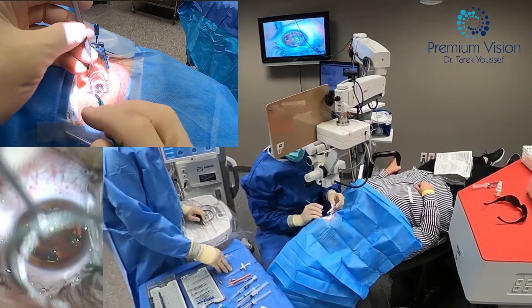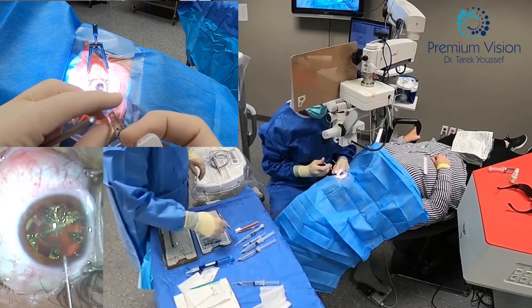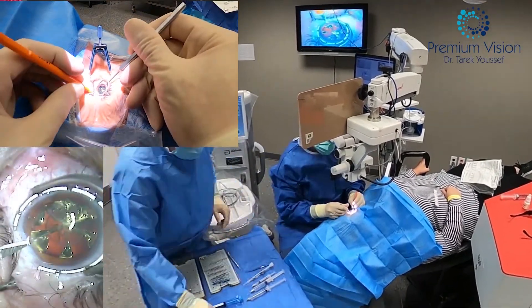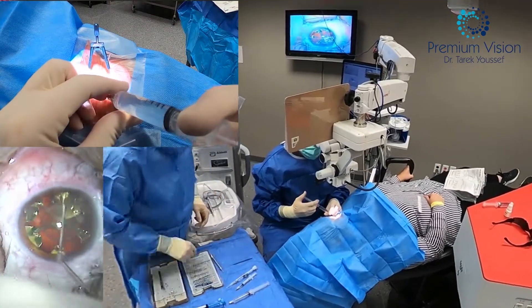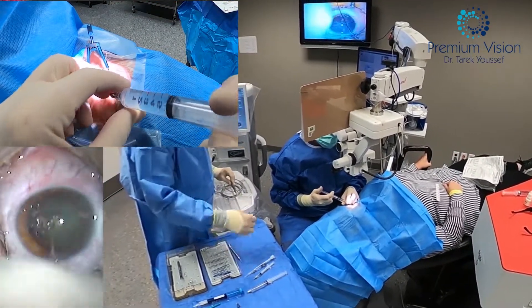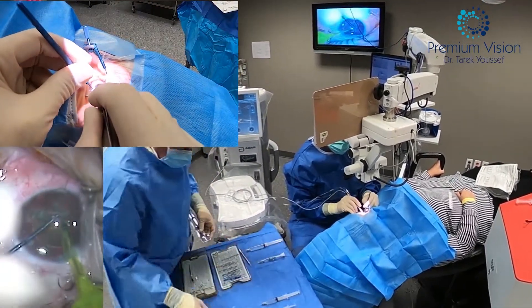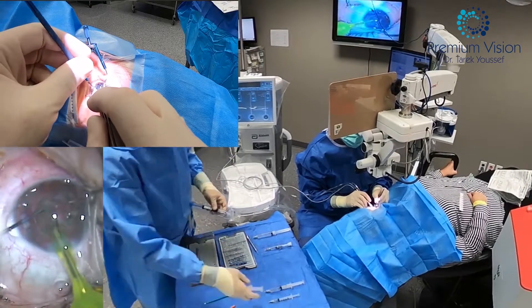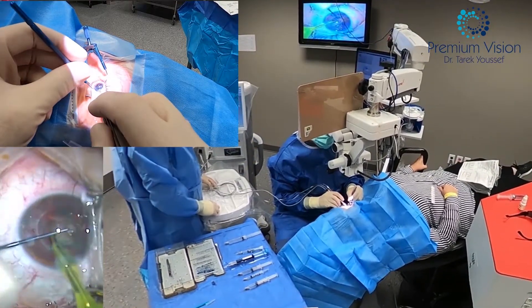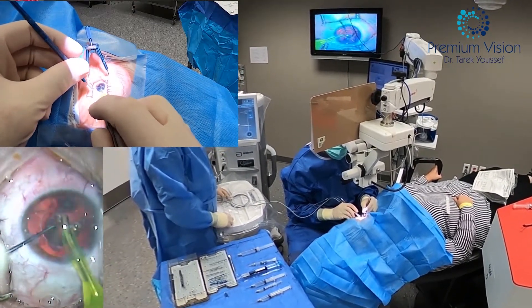Washing the cornea. Starting the incision. Applying endocoat. Second incision. Hydrosection, hydrodelineation — and here we have to make sure it's going all around because the lens is divided. Doing the chopping — it's already chopped, so you just move the segments apart by pulling with the chopper sideways, not centrally.